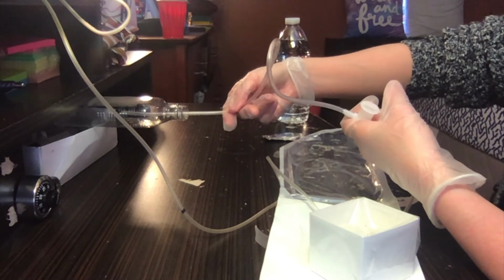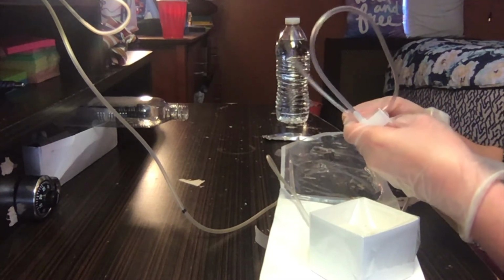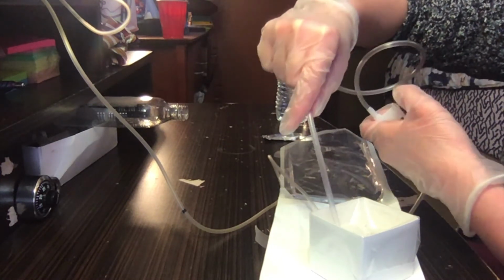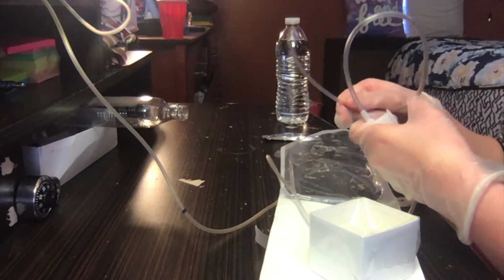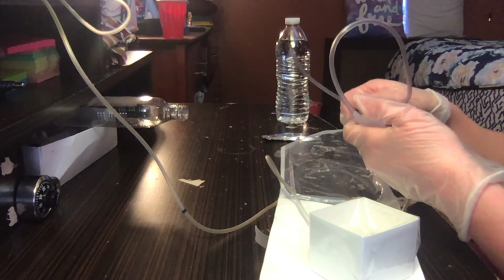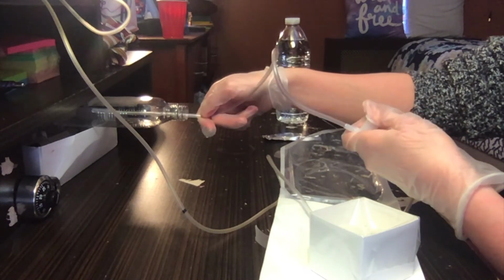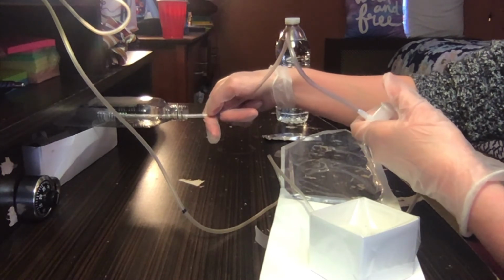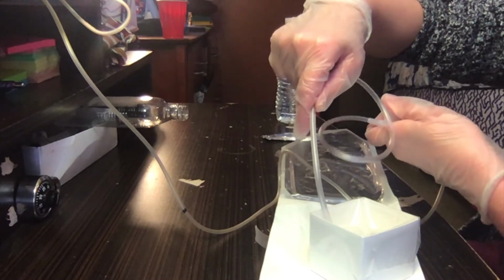Now that I'm done my first round, I'm going to take the tubing out, and I'm going to allow 30 seconds to 1 minute between suction attempts, and I'm going to clear the tubing by suctioning up the saline. Now that my tubing's clear, I'm going to alternate the nares, and then I'm going to start my suction again, doing the same technique. And I'm going to clean the tubing.